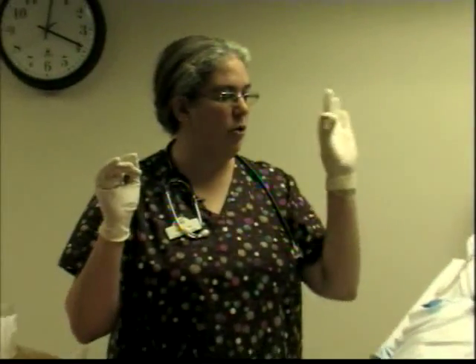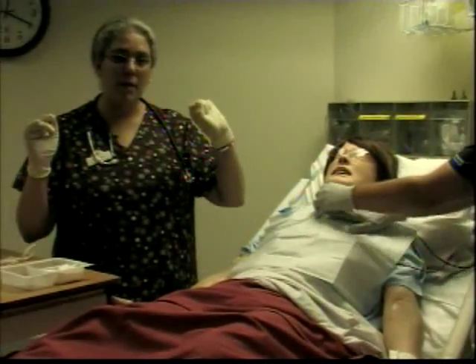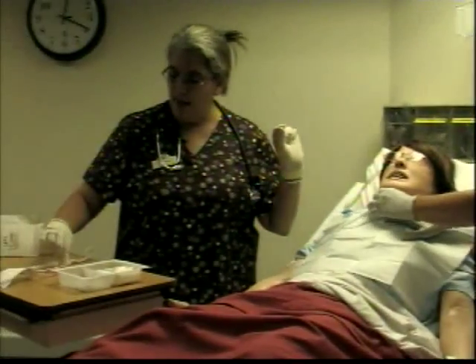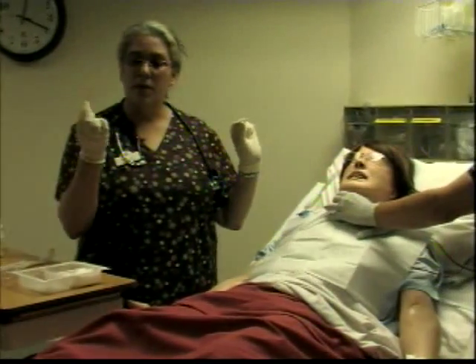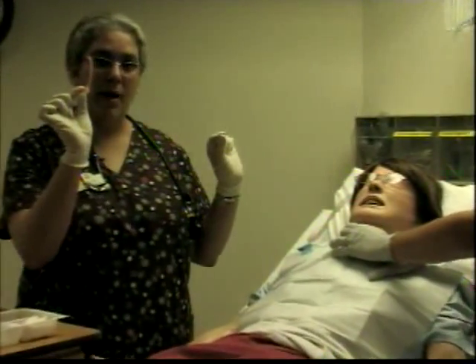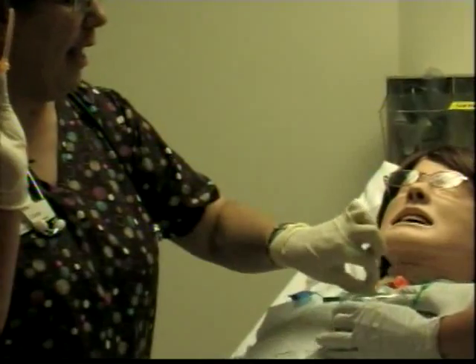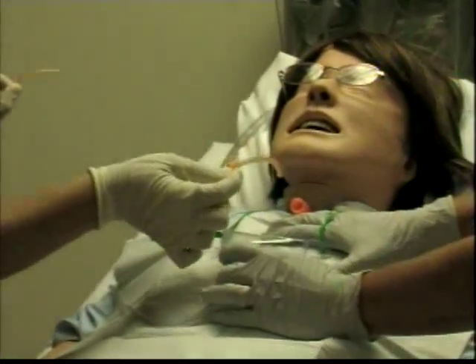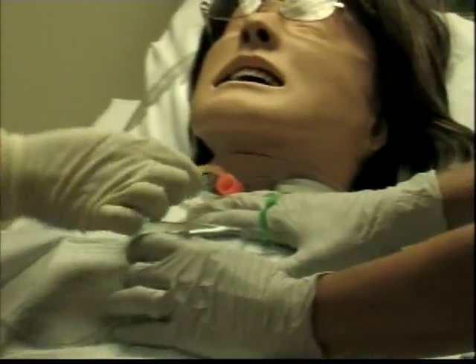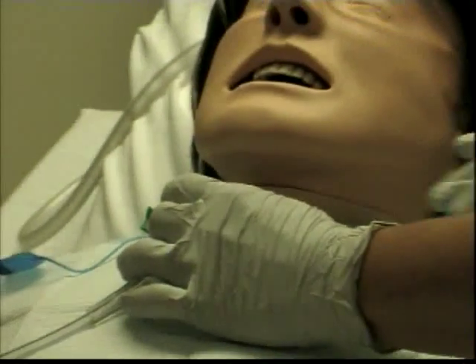So my assistant is going to remove the oxygen, and I'm going to grab the inner cannula with my non-dominant hand. And with my dominant hand, I am going to grab the new one. You see how I'm touching it? I'm just touching the outside of it with my gloves. And then as she removes it, I'm going to take the inner cannula out, and I am going to put the new one in without touching any corners. And I am going to push it in place, and click it in place, and this goes into the red bag right here.